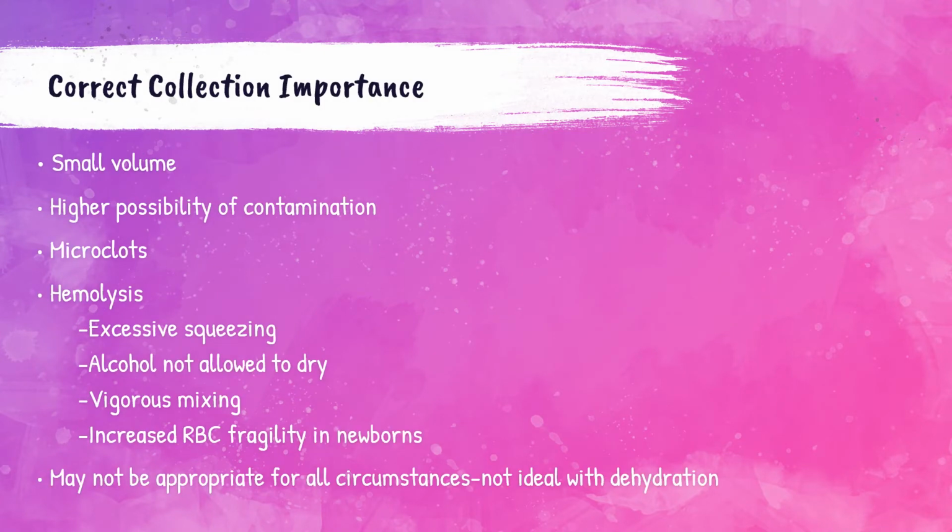So why don't we just use dermal punctures for every blood test rather than using venipuncture? So there's a number of reasons for this. So first, dermal punctures provide a much smaller volume of blood than a venipuncture procedure does. So some tests just require more blood than a dermal puncture can provide. Also, a smaller amount of blood collected can lead to a higher risk of contamination from the skin.